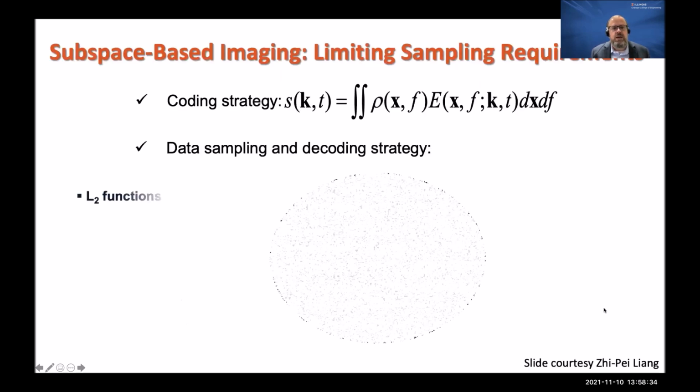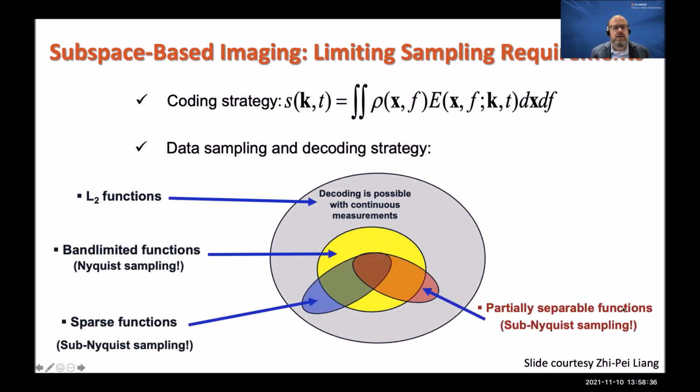And so for this, we end up having to look at how we're modeling the image itself, the four-dimensional image itself. And we need to look for images in a domain that captures what we're looking for, but limits the amount of independent pieces of information that we have to estimate from our data set. And we need to start thinking of this as a 4D estimation problem.